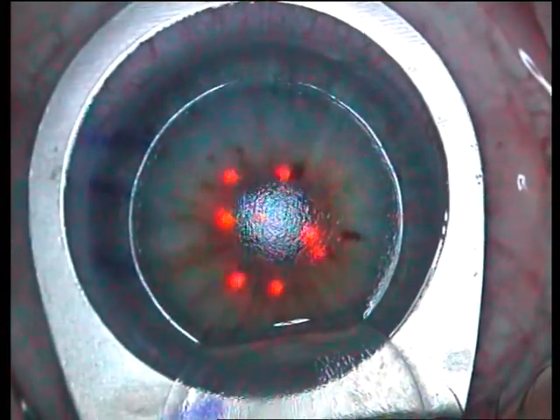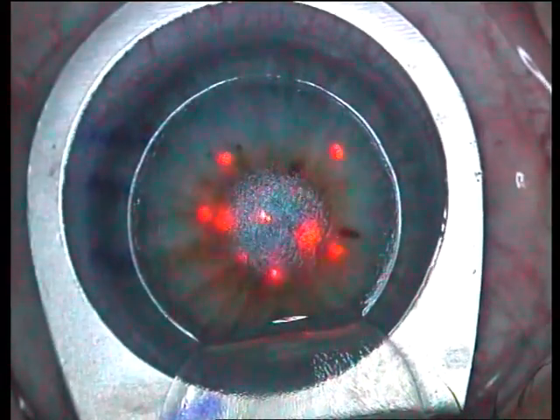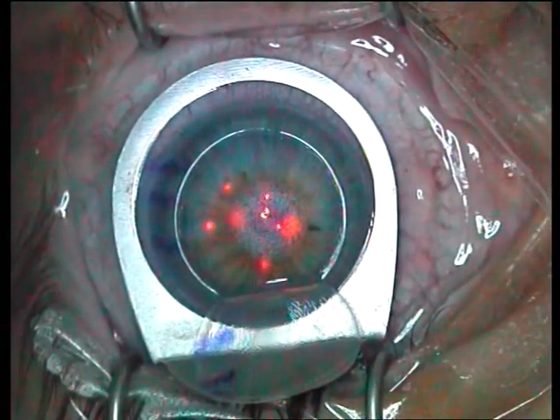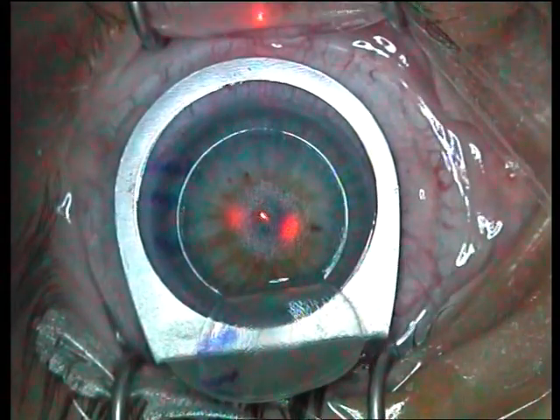The laser is now started. The patient is encouraged to constantly look into the center of the red glow. As you can see, the patient's fixation is fairly good, but the eye tracker on this machine is excellent. I am using the MEL-80 by Carl Zeiss.